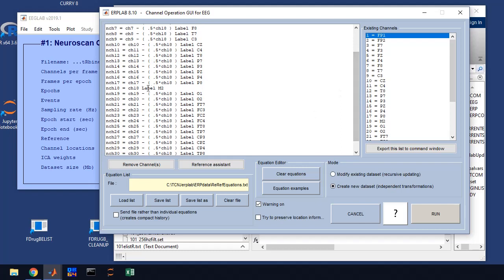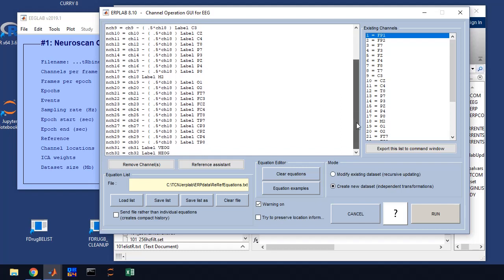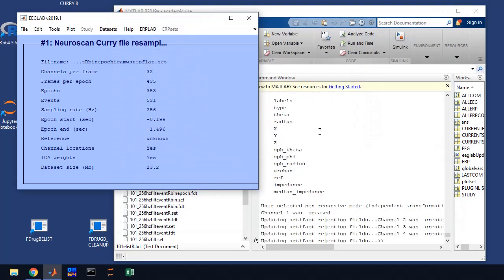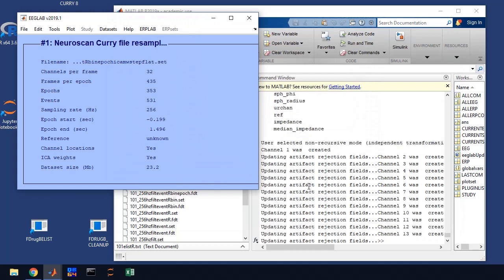This is our right mastoid, so we leave that channel alone, and of course the vertical and horizontal electrodes are referenced to themselves, it's a bipolar reference, so we don't mess with those channels, but we re-reference all of the other channels. And we're going to create a new data set when we run this.